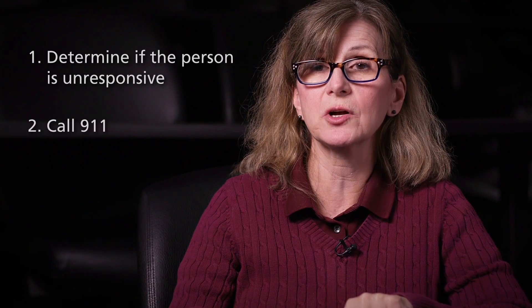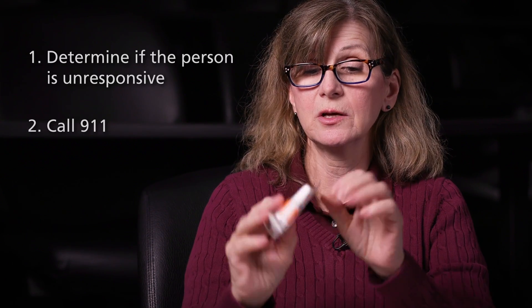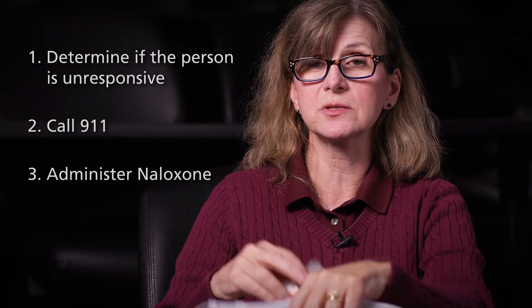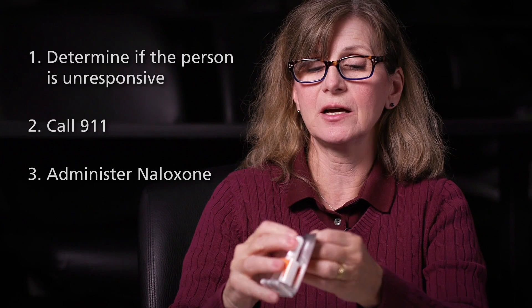So immediately you want to call 911. Then you want to get the naloxone out of the kit — it's super easy. You're going to open up the foil packet. Very simple.